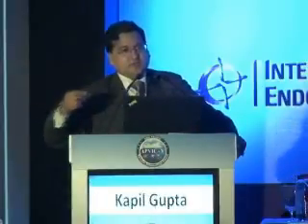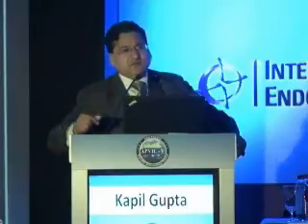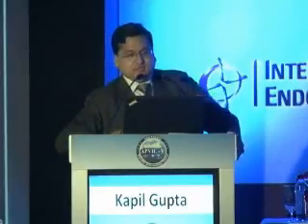Then we remove the balloon from the lower end. From the top end, we introduce the balloon to the distal arterial puncture site, remove the wire, and then introduce the soft end of the wire from above and do all the procedure from above. We use a 3 by 100 millimeter balloon at top and 2 by 100 in the distal part.